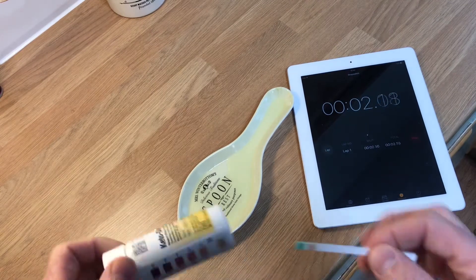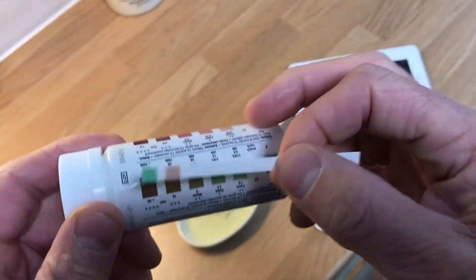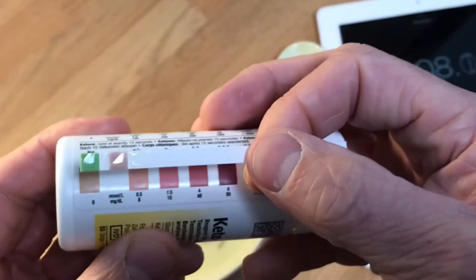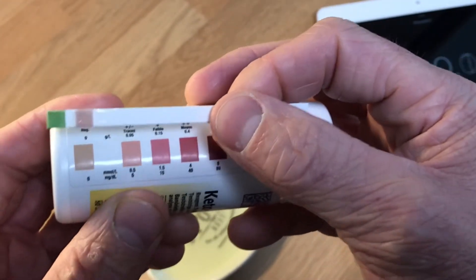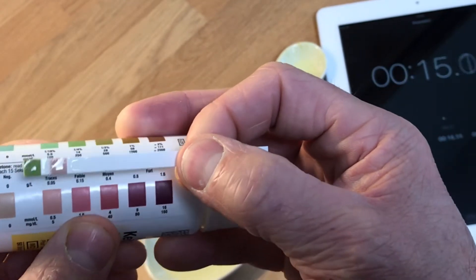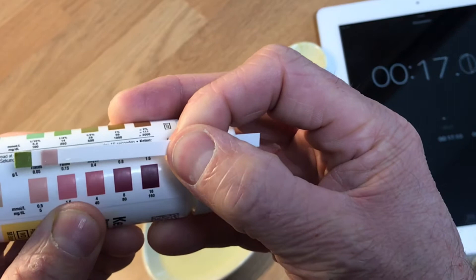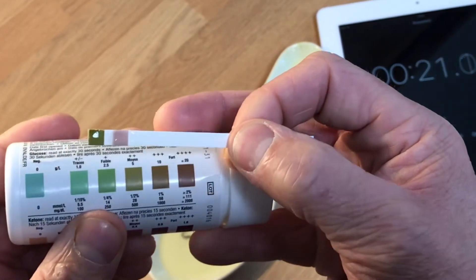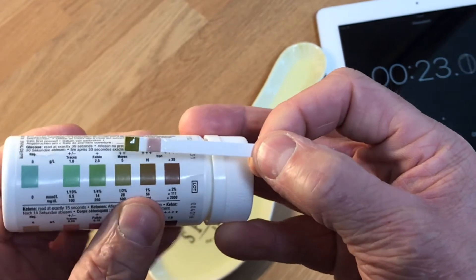Right, let's get started. Put it in the wee, start the stopwatch, get your bottle. Ketones first — coming up at 15 seconds, looking like 0.5.